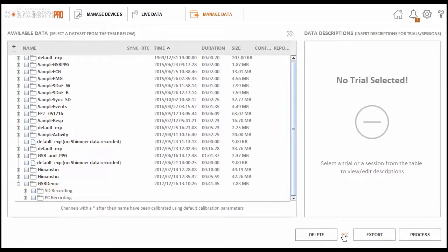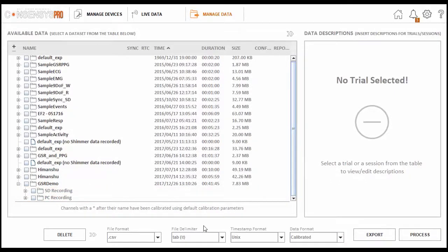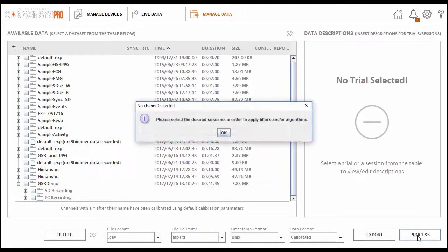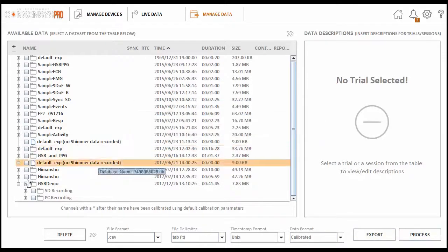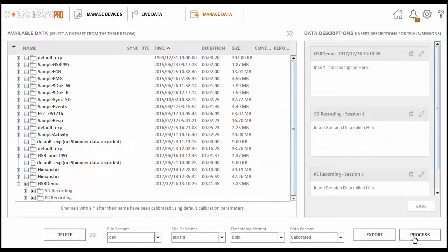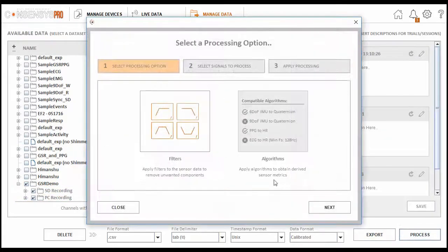The final step is to export the data if we wish to process further, in advanced data manipulation programs such as MATLAB for example. We select the trials we want to export. The raw data can be exported in a number of different data and time formats to the user's preference. Also at this point, filters and algorithms can be applied to the data if appropriate.